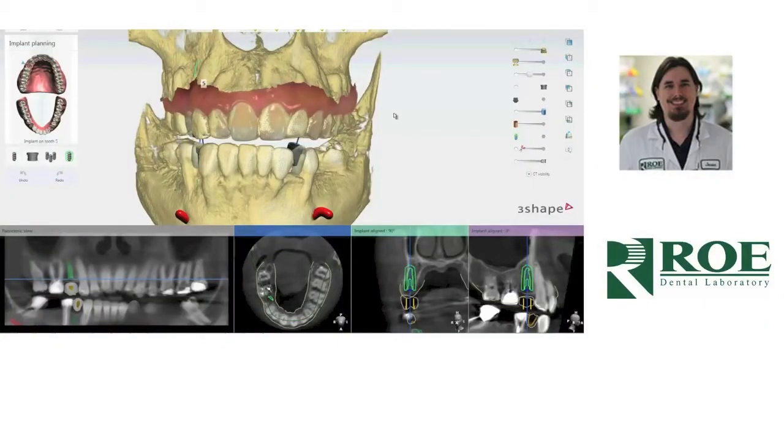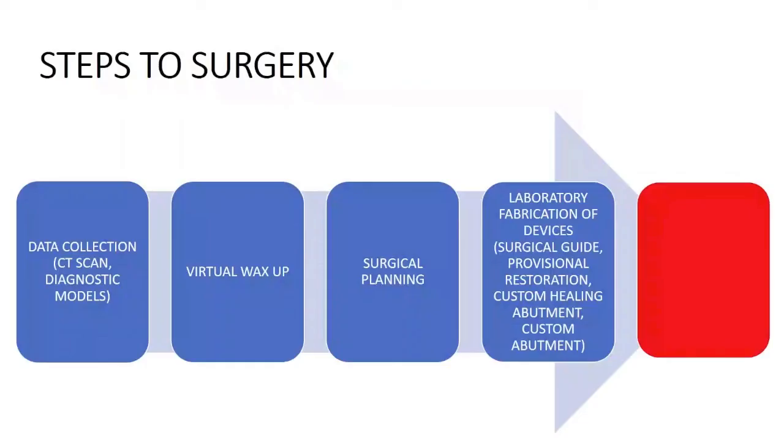At this point, Ro's done all the planning, except this isn't Ro's patient. This is my patient, and I'm responsible, and I'm liable for this patient. So I have to decide if I like what Ro did. So what happens is there's an online meeting that's set up. So there's Jason, who I worked with on this case.